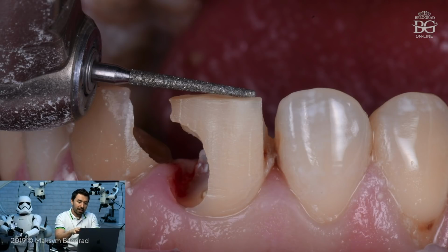This sequence has some benefits. First, after you finish step 1 of preparation, you understand the geometry of the final design of the prep, and it may help you to choose the exact amount of build-up material to save your time. So that is an interesting approach: when you do endo, you first do the restorative part before you do endo.